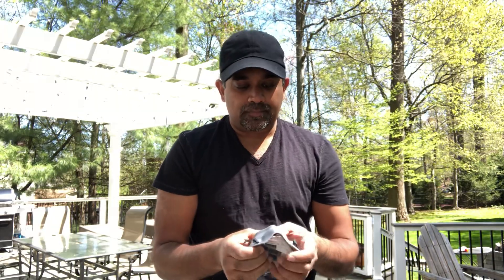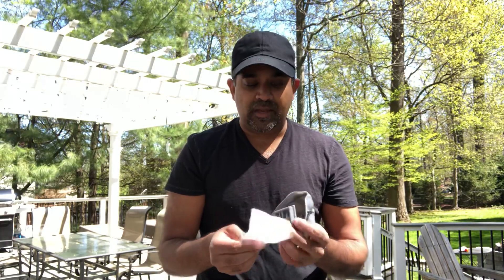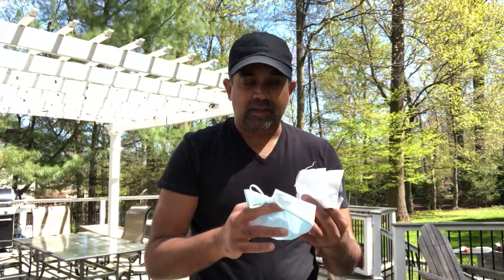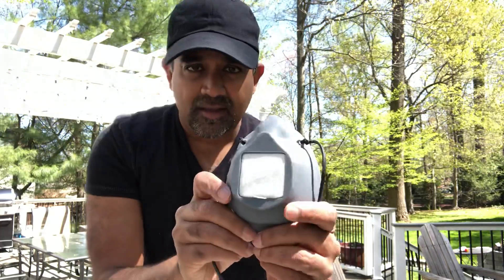The filter pieces can take any filter you want. There's a study from George Washington University about these 3D printed DIY masks — I'll post a link. They use MERV 13 or MERV 16 HVAC filtration paper. This happens to be MERV 13, and we're using three layers. There's some controversy because some HVAC filters use fiberglass. The George Washington study says MERV 13 rarely uses fiberglass, but MERV 16 does. As an alternative, you can take a Level 3 surgical mask, cut it, and put it into the custom mask — just pop the paper in from the inside.